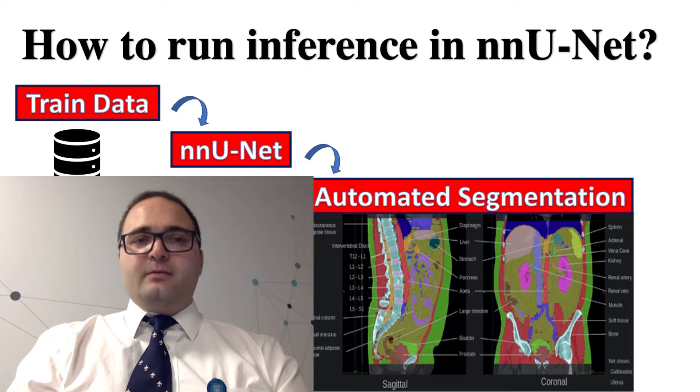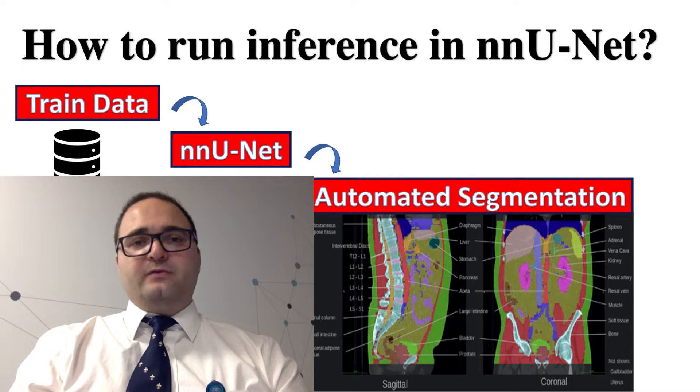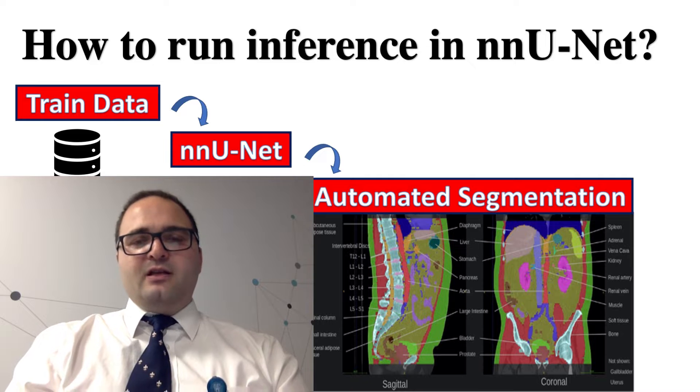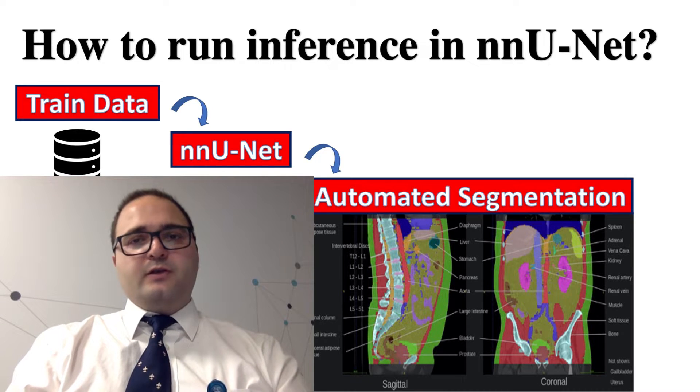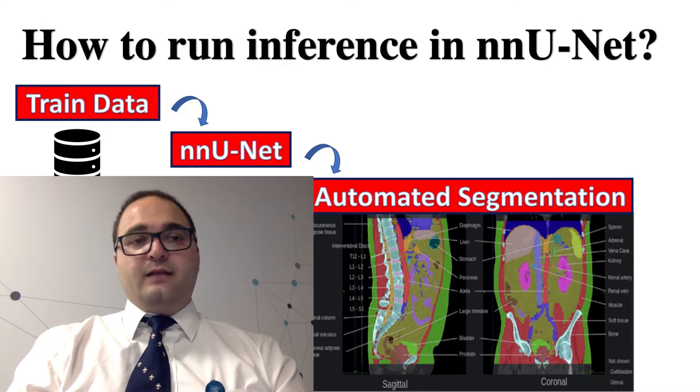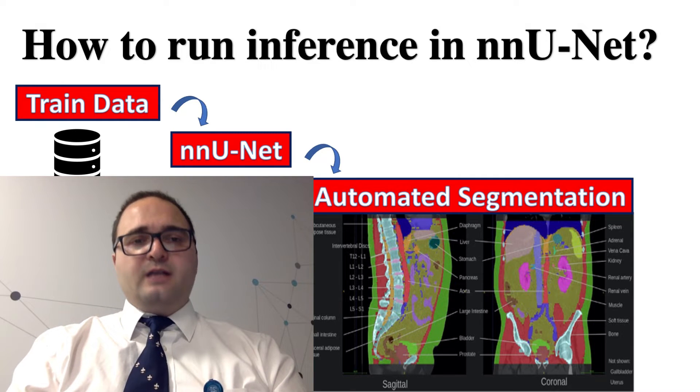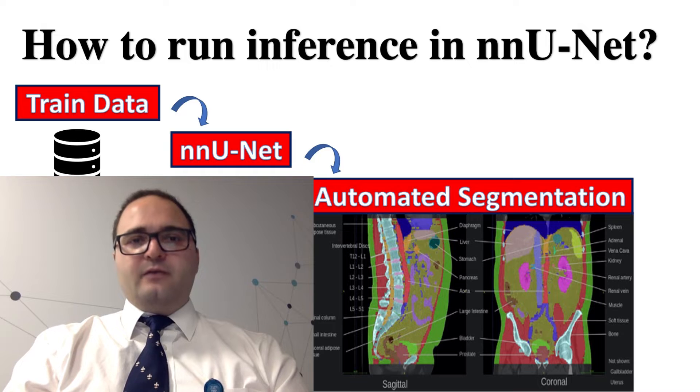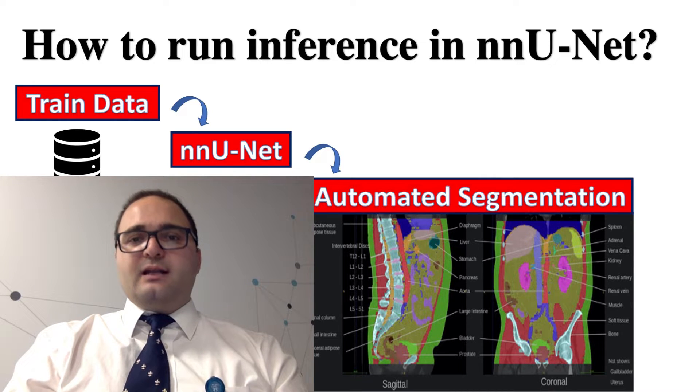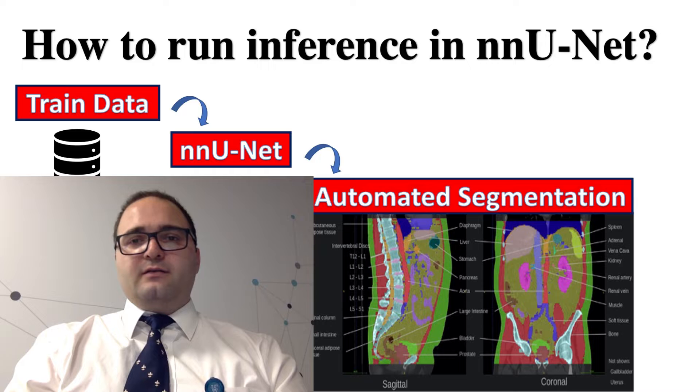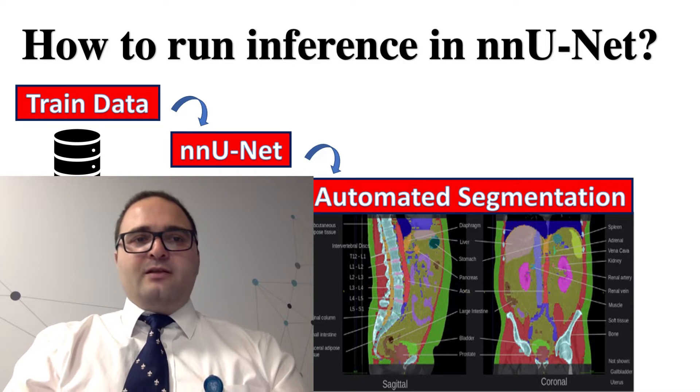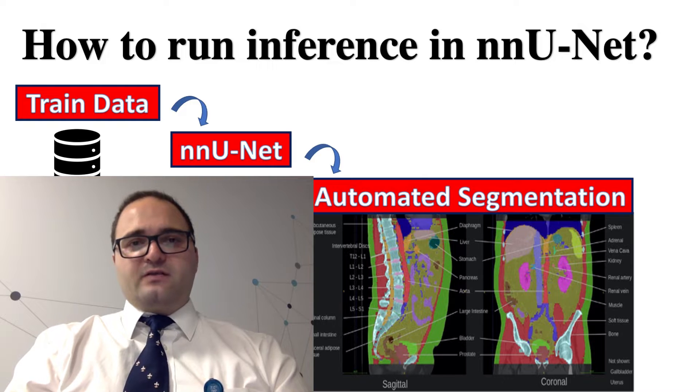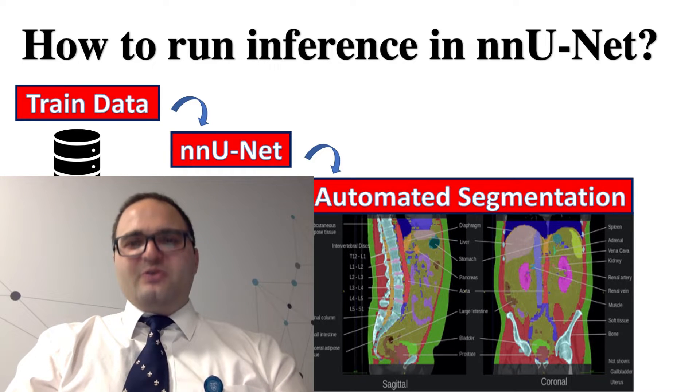In previous episodes, I showed you how to install and then train a segmentation model using nnU-Net, and today we want to see how to infer on unknown scans and how to compute desired metrics by nnU-Net. Please watch this tutorial and follow the instruction, and I hope you enjoy it.